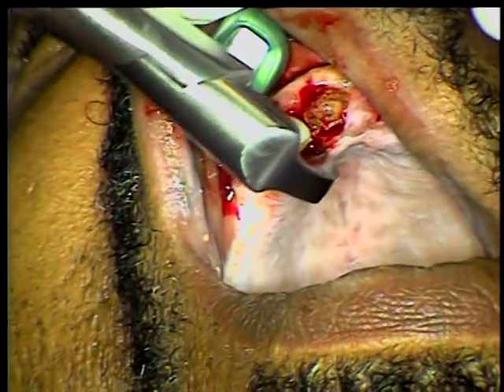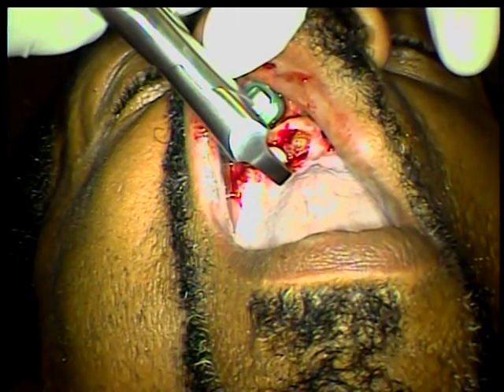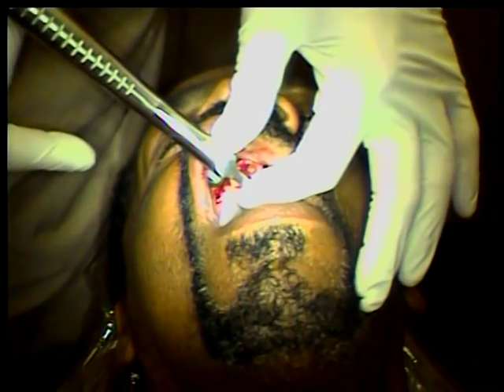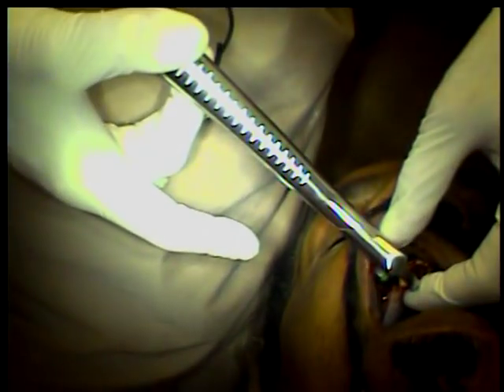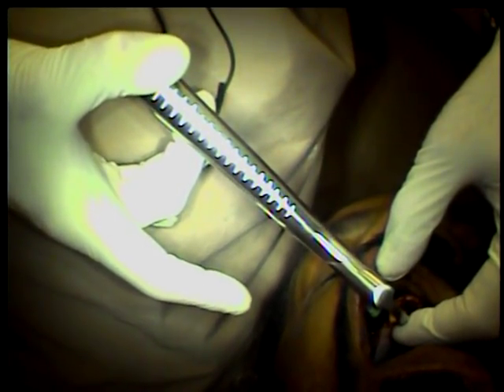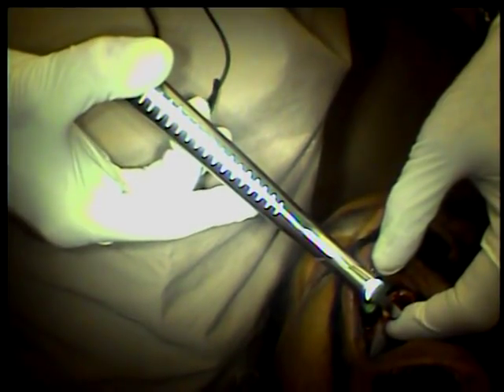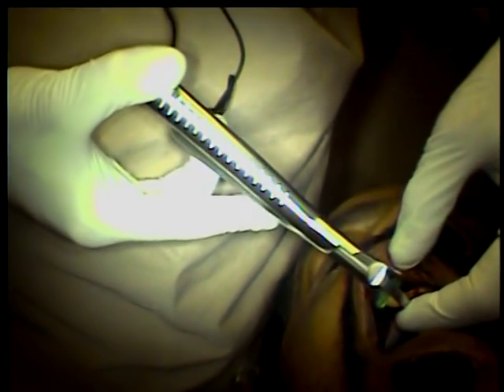Just a lot of pushing. Let the energy build up. That's all my wrist. I'm going to take this tooth out with two fingers — I'm just torquing it, three fingers. I'm just waiting for the energy to build up, and the tooth came out.